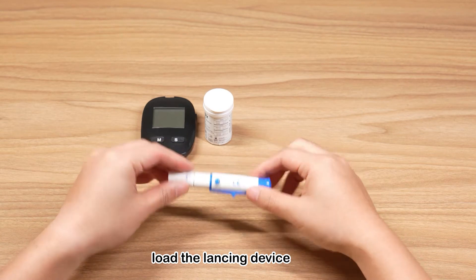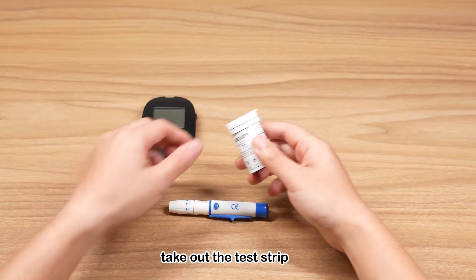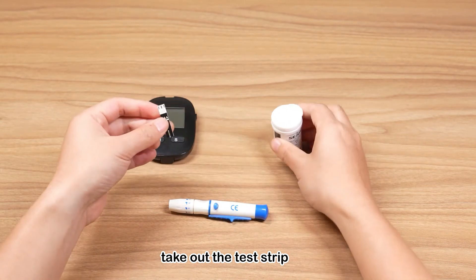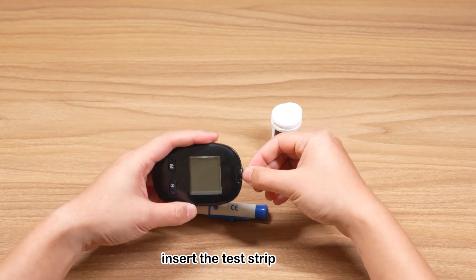Load the lancing device. Use the test strip immediately after you open the bottle. Insert the test strip and check the flashing mark on the screen.